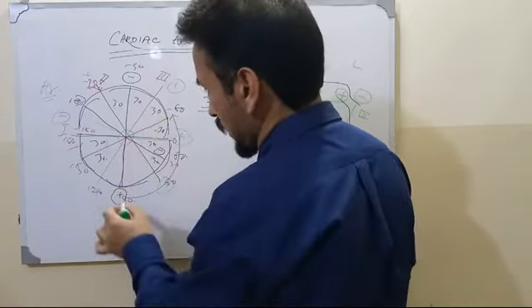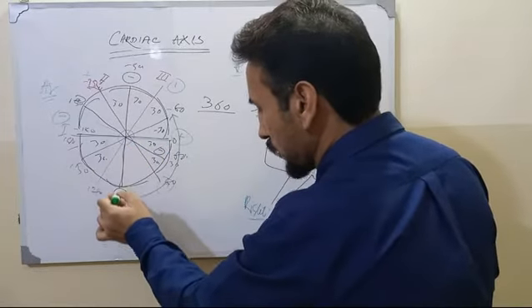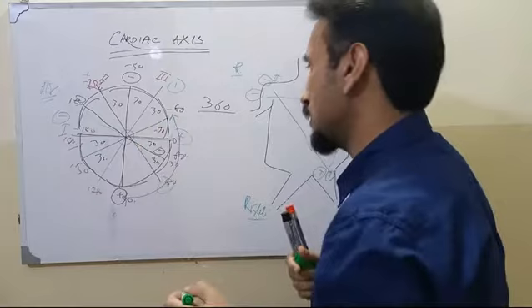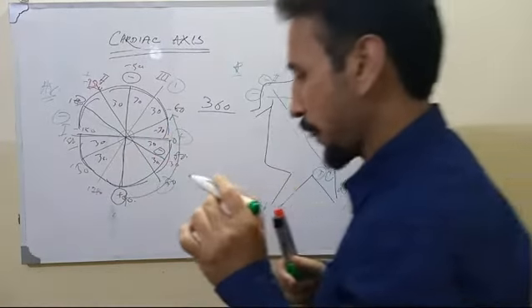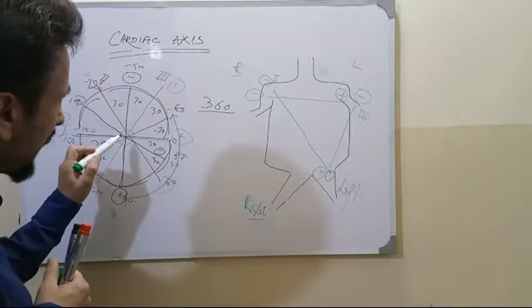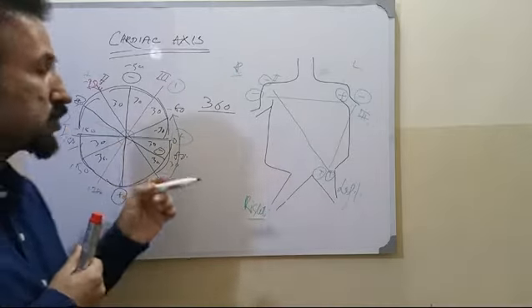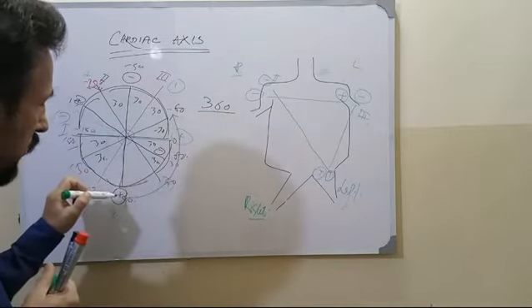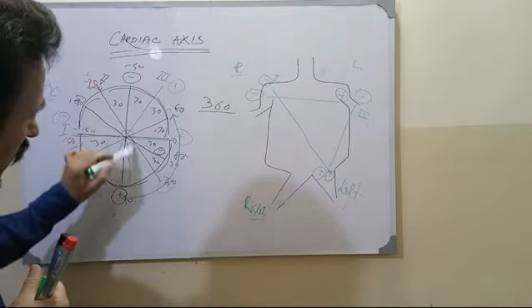So it may lie here, here, here, anywhere between plus 90 and minus 30, which makes the normal cardiac vector. Now the important thing here is that Dale Dubin has described the cardiac vector lies from 0 to plus 90, but the other books have mentioned it ranges from plus 90 to minus 30. This is the normal cardiac vector.